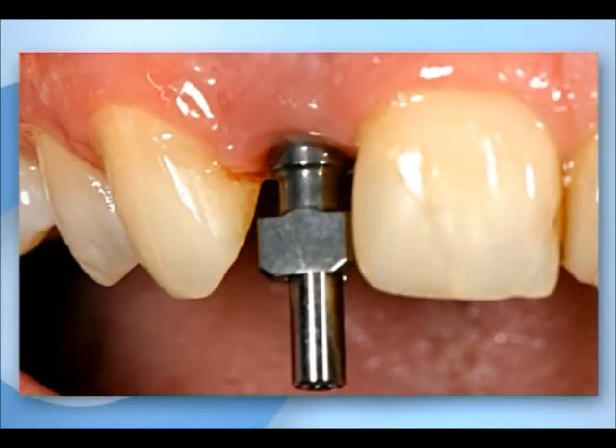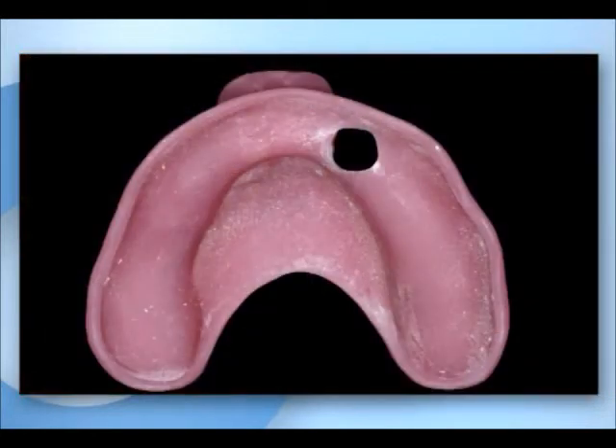The removal of the gingival former, approximately one week after gingivectomy, allows the insertion of an impression post. In this case, a custom tray was produced and used for the open-tray impression technique.